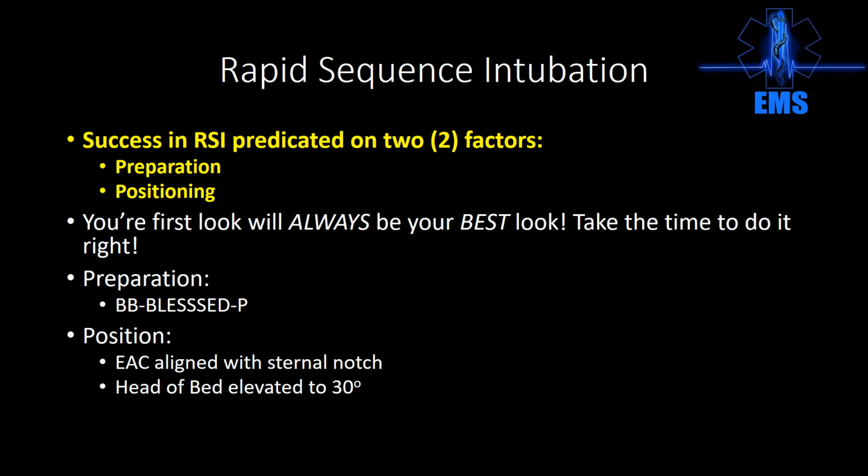I'm going to say it over and over again. Your first look will always be your best look because you're primed. Your mindset is right. Your tools are right. You have been intubating before. You know which blade you like to use. You know what size blade you like to use. You know which tube you like to use. You know which angle you like to use.